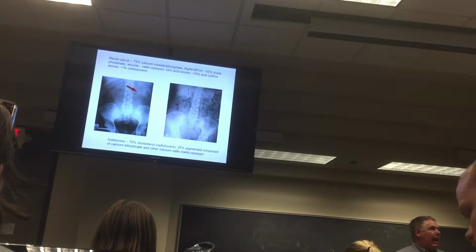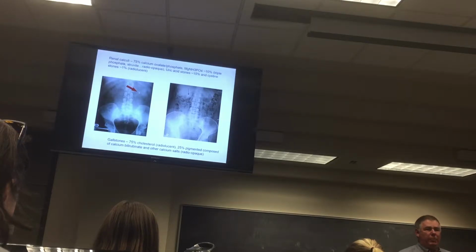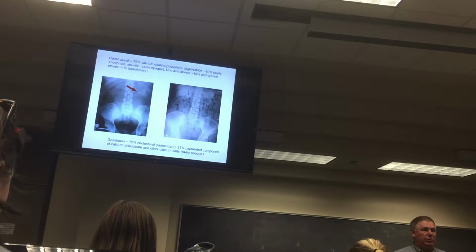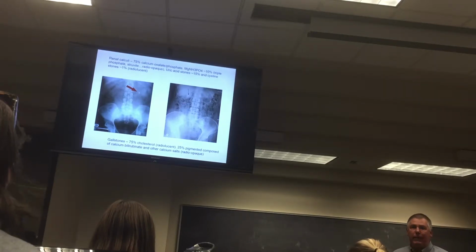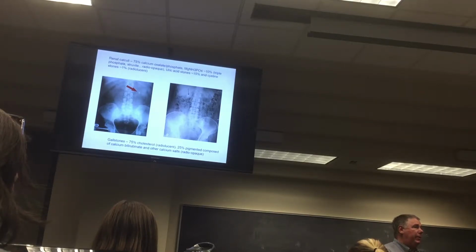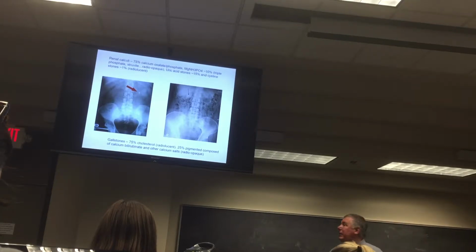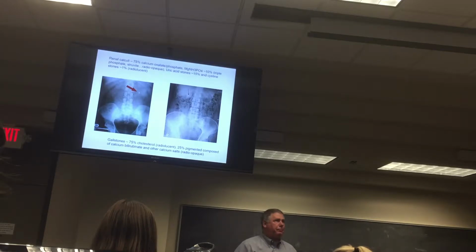A middle-aged or older guy with a history of kidney stones, and it's probably a kidney stone. The good thing about kidney stones is 75% of them will show up on a plain X-ray. All of them will show up on a CAT scan, but 75% of them will show up on just a plain X-ray. So if they're in your office, shoot a quick X-ray to see if you can see it. As you can see on the image on your left.